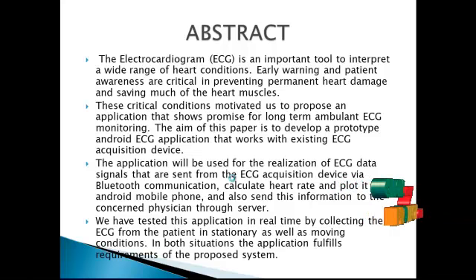This is the Android application developed on the Android operating system. It will act as the graphical user interface of the system, so the user can easily interact with it. Data from the ECG sensing hardware can be shown in graphics in a smartphone application. The ECG app framework is used to easily integrate this application with any other Android phones.